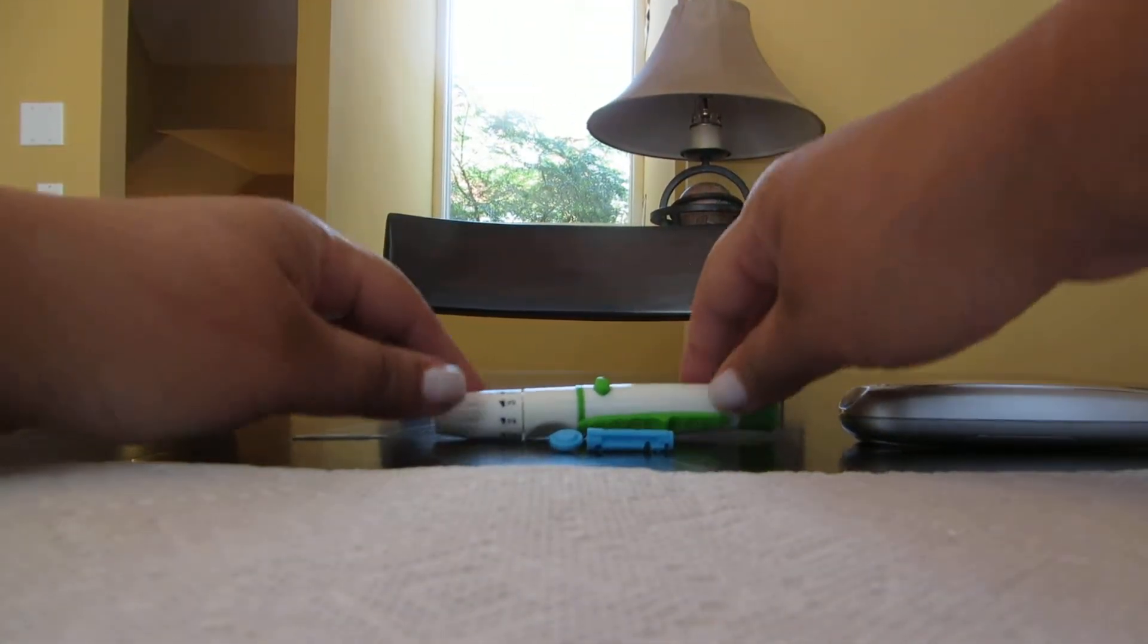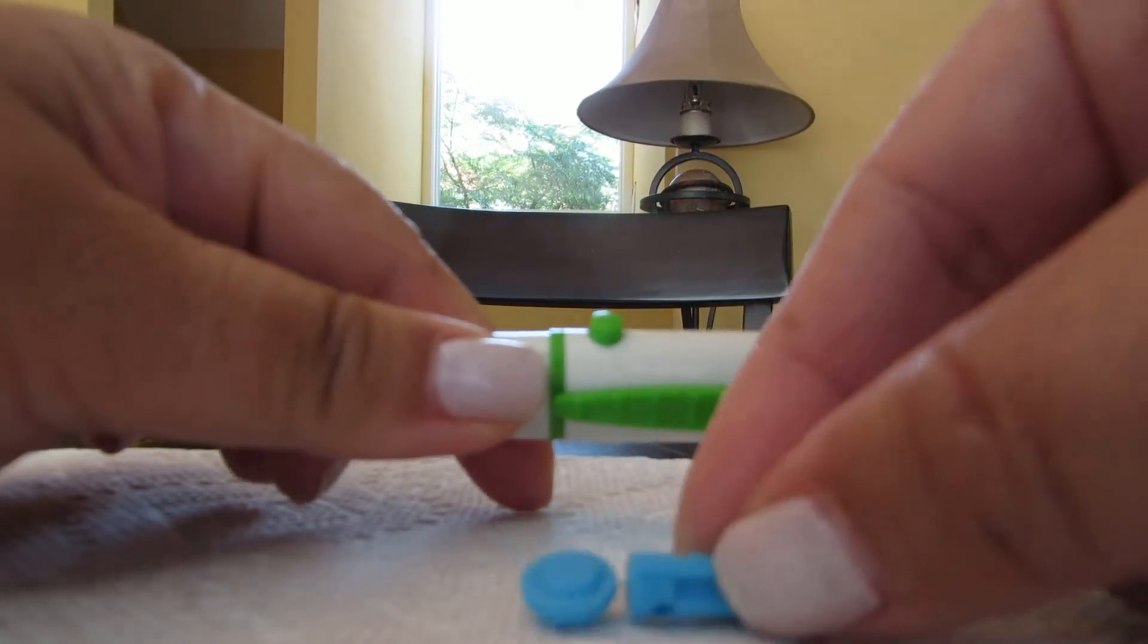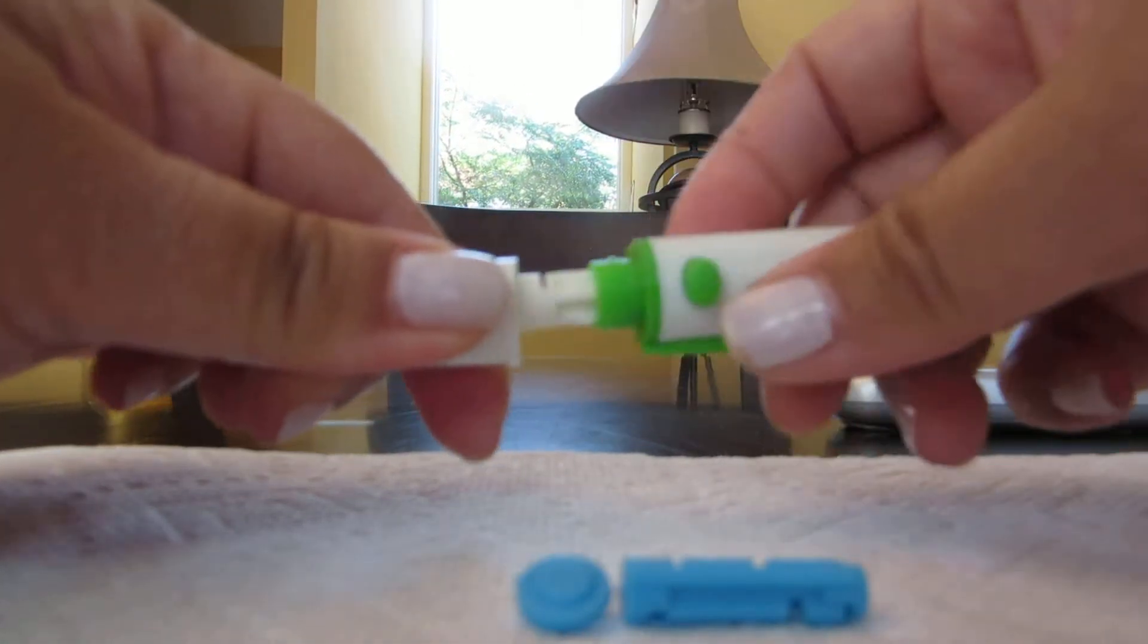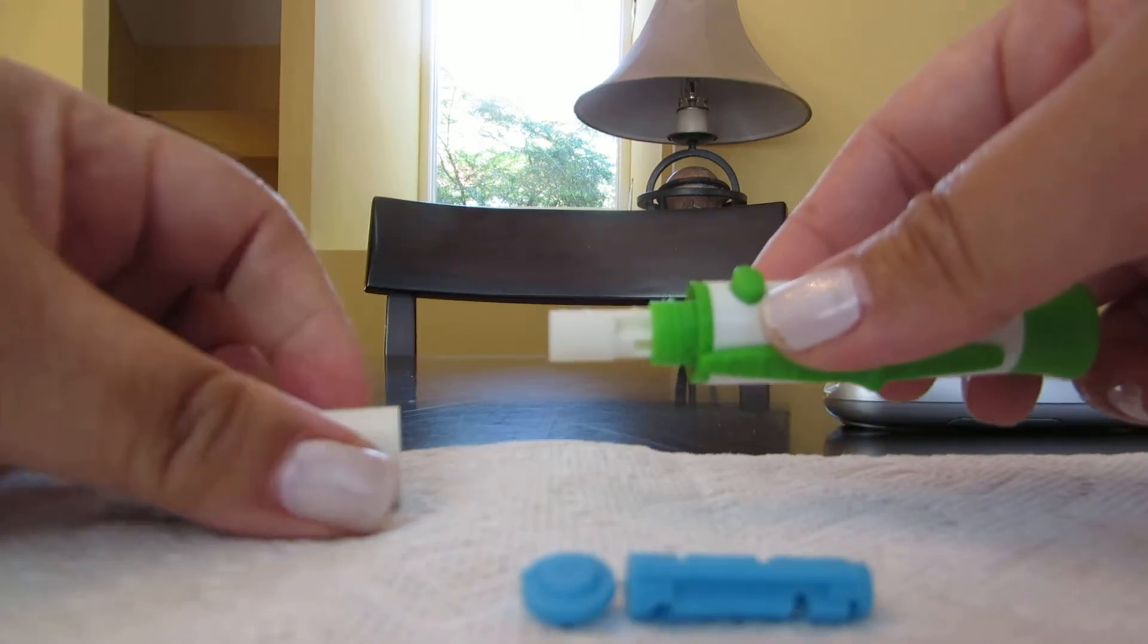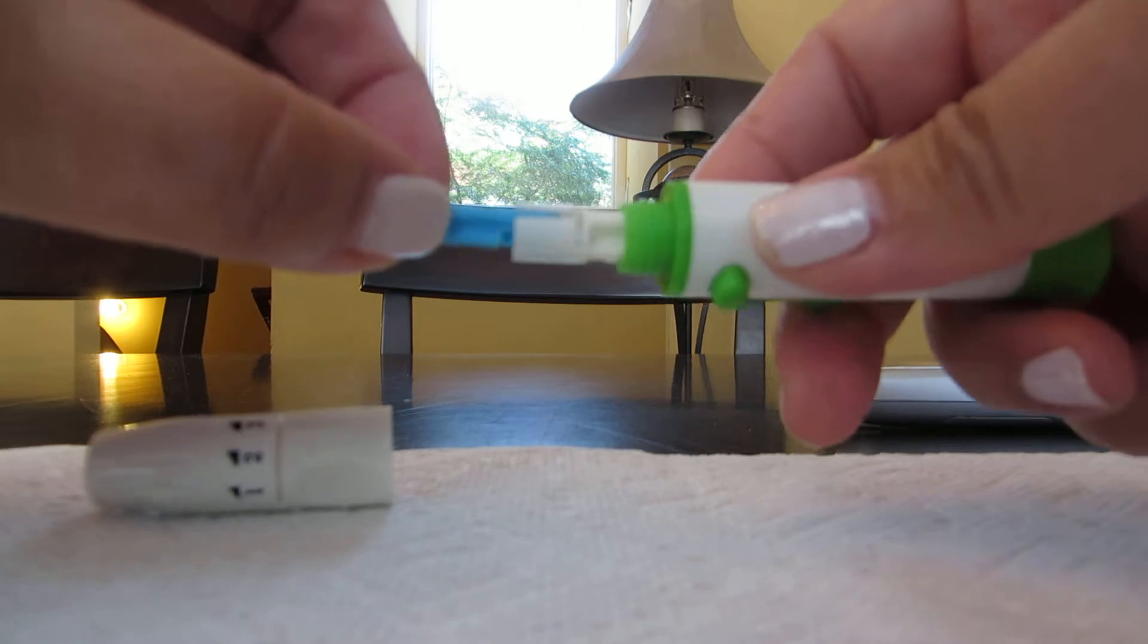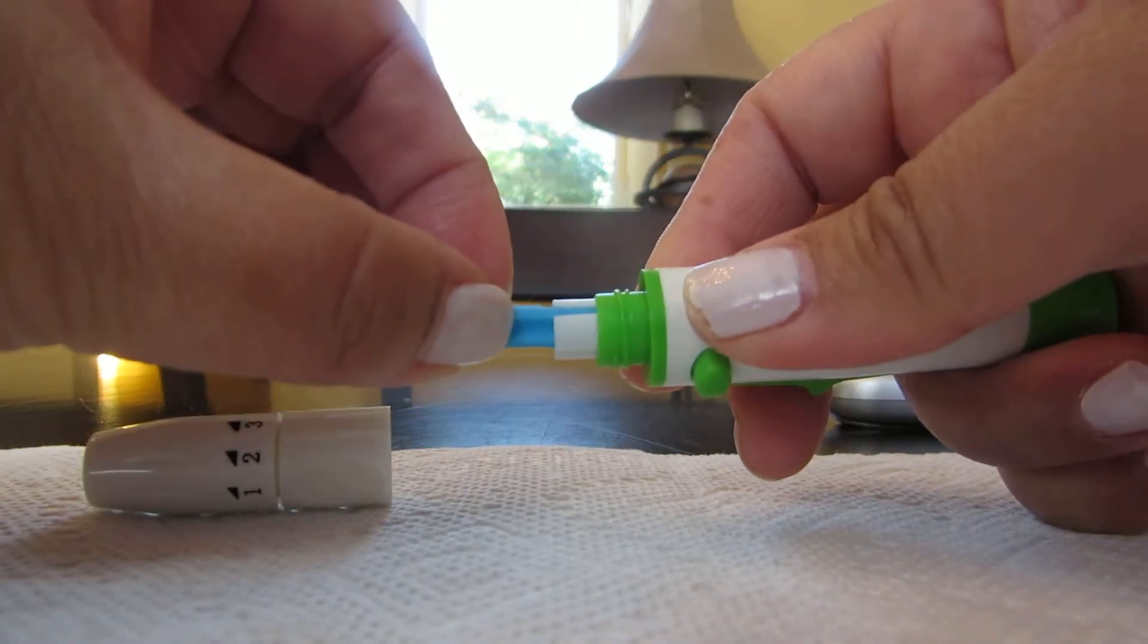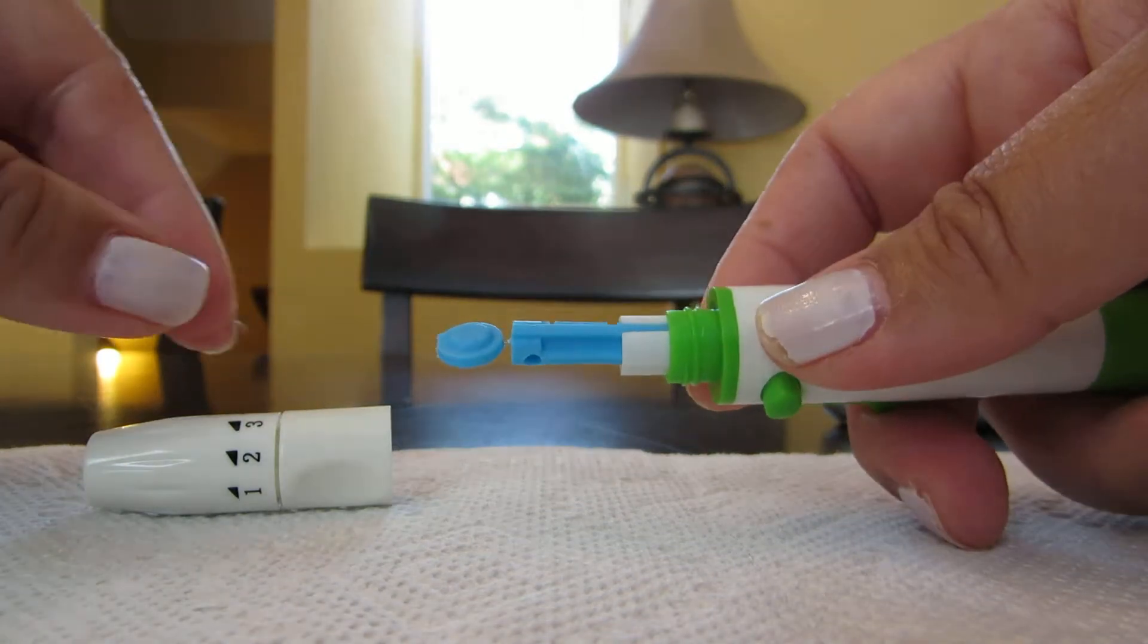After washing your hands, we'll put the lancet together. You have a lancet and its needle, so unscrew to take it apart, put the needle in, and press down so the trigger is ready.